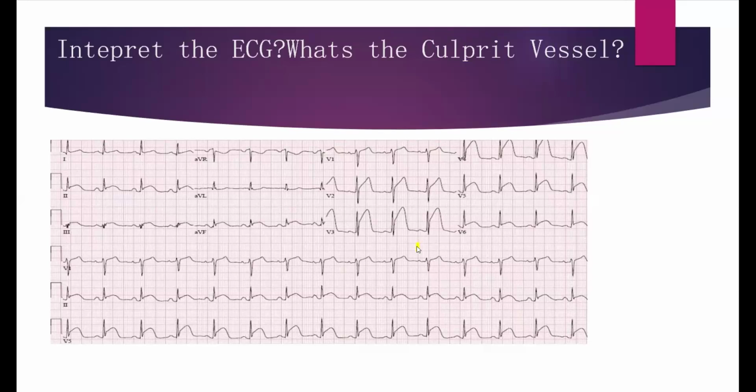Okay, so this ST elevation, which is okay, on V2, V3, V4, 5, and also on 2, 3, I would say there's like a diffuse ST elevation. Excellent. There's diffuse ST elevation.